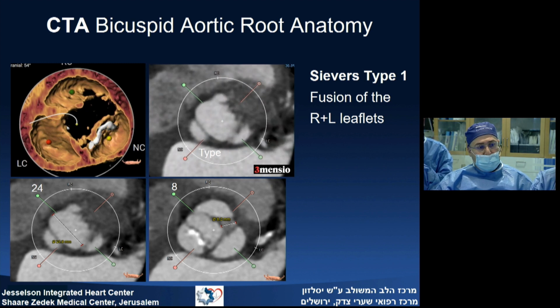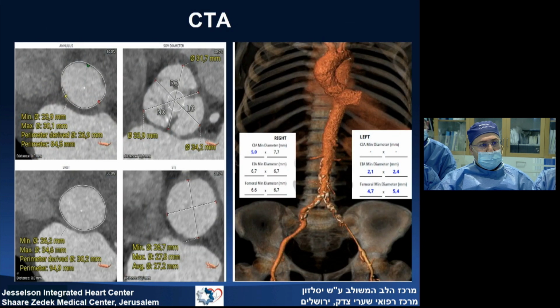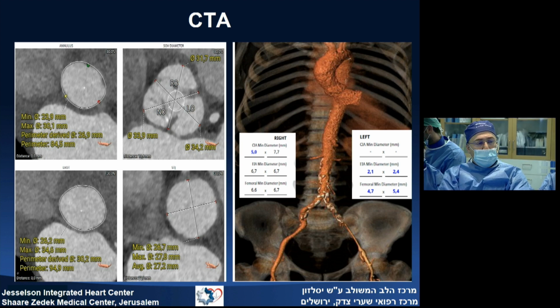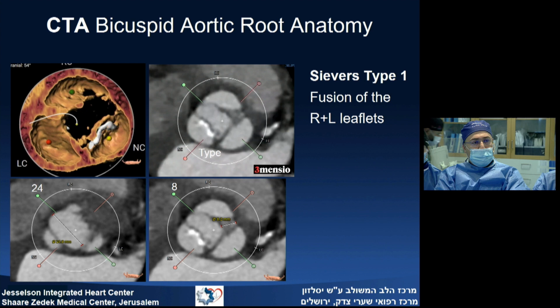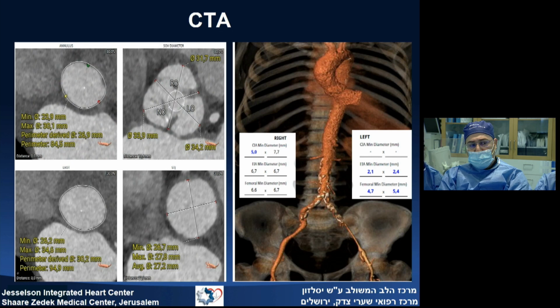Danny, I think it's a great point of discussion. I have some comments. Looking at the phenotype of this bicuspid valve, the raphe is barely calcified. There's very little calcium on it, right? So basically what I have been doing, when I have a situation like this, that I don't see much calcium in the raphe, these valves behave very much like a tricuspid valve. So personally, in this case, I would probably go with a 34 rather than a 29 because of that. If this raphe had more calcium on it, then I would definitely consider a 29 because there's going to be very little expansion toward that area. But in this case, particularly, I would pick a 34 valve. I don't know what the others would do.